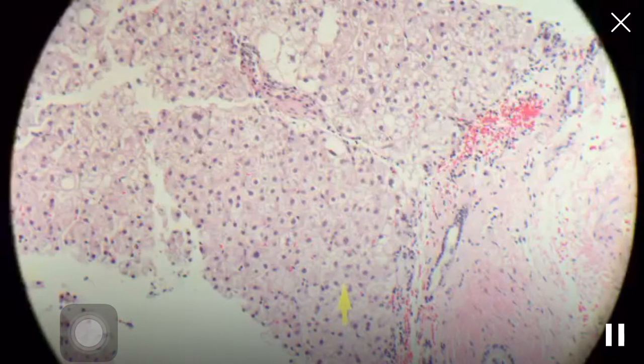If there's a huge amount of it, I'm going to get a little more aggressive about suggesting that alcohol could also be responsible, because non-alcoholic fatty liver disease usually, not always, but usually doesn't have very prominent ballooning and very prominent Mallory-Denk bodies. You usually have to search for it like this. On occasion you see cases where it's much more extravagant, but where all these things are more extravagant, I'll tell the clinician, not in the report, because there are social and medical legal consequences to putting alcohol in a report. But I'll tell the clinician personally, hey, really make sure you're excluding alcohol in this case.